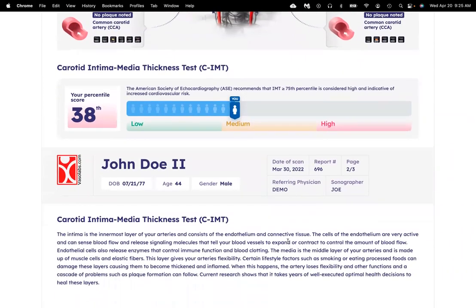At the bottom of this first page, you'll see what percentile you are in for your IMT thickness. We determine this by comparing your measurements to a population of people your same age and sex. In this case, this person is in the 38th percentile, which is a medium-low risk.